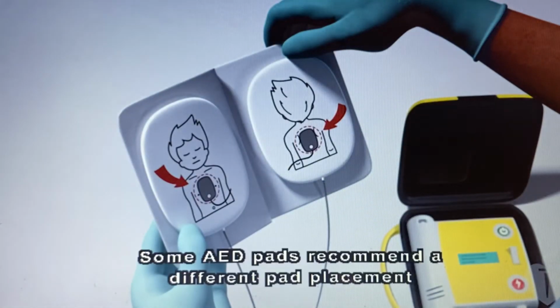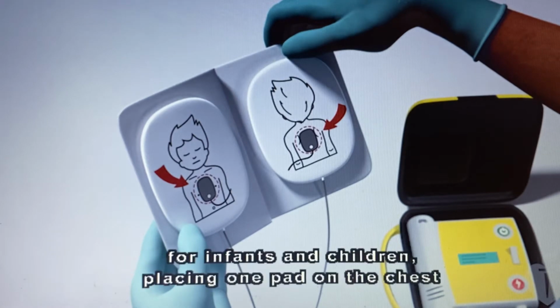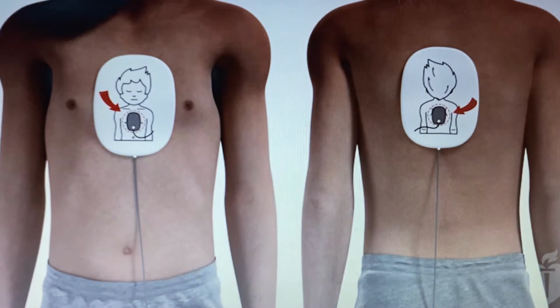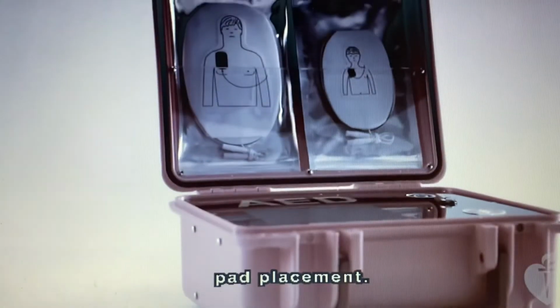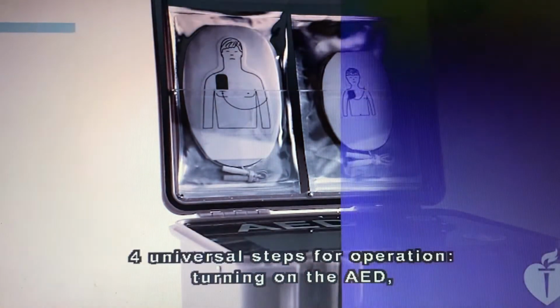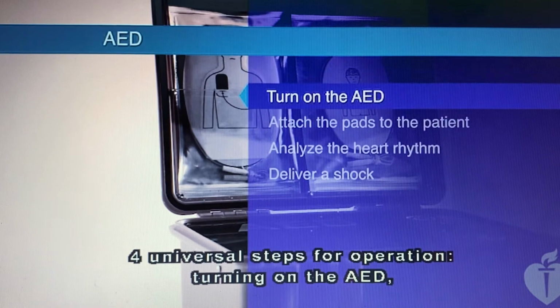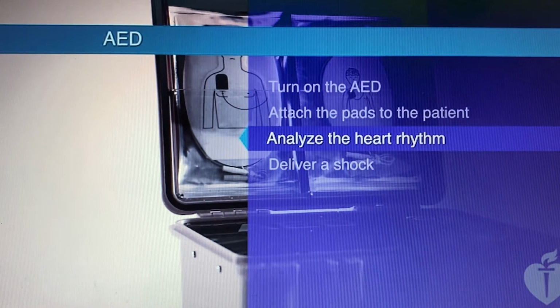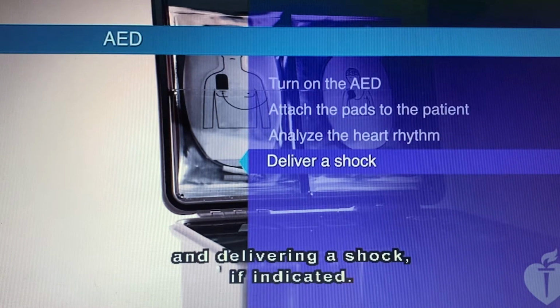Some AED pads recommend a different pad placement for infants and children, placing one pad on the chest and one pad on the back. Follow the pictures on the pad packages for proper pad placement. Although AEDs may differ slightly, there are 4 universal steps for operation: turning on the AED, attaching the pads to the patient, analyzing the heart rhythm, and delivering a shock if indicated.